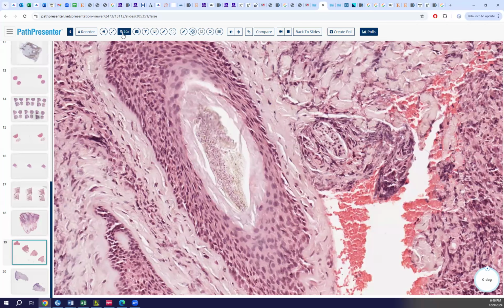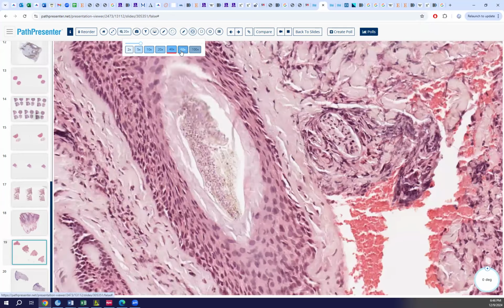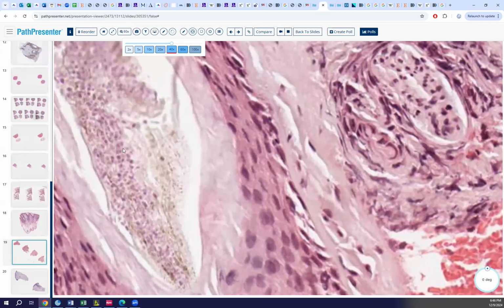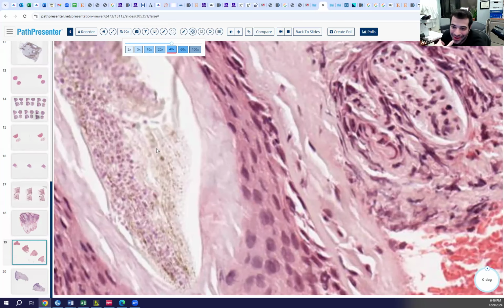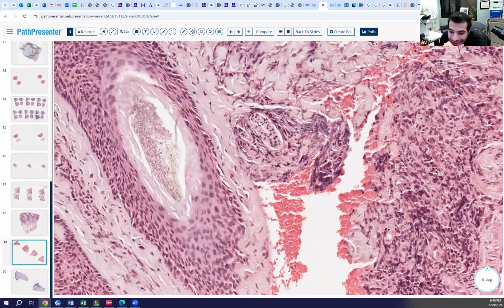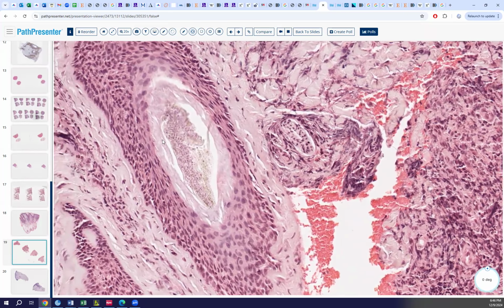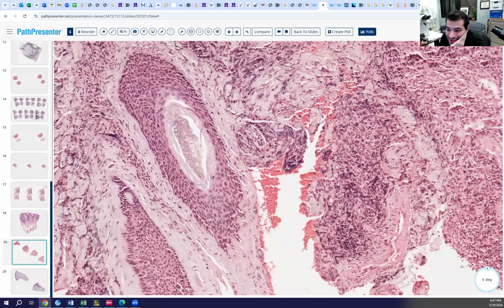It looks like a bunch of eosinophilic material. It's pink. It's staining basophilic in some, like purple really. But what do we think they are? There's a circle in some areas, they're lining up like this. What might be lurking in a hair shaft? Fungus. Majocchi's, fungal folliculitis.